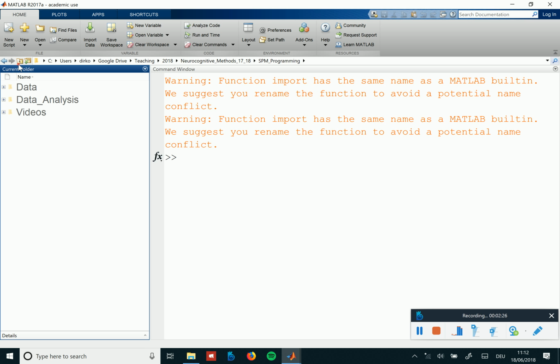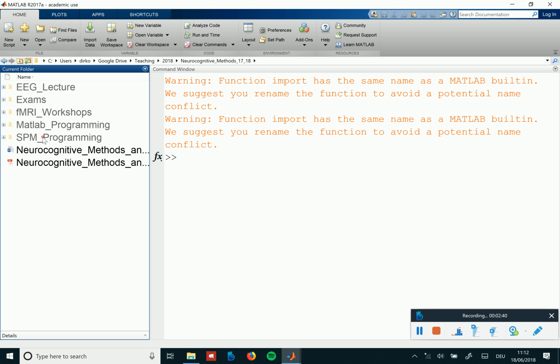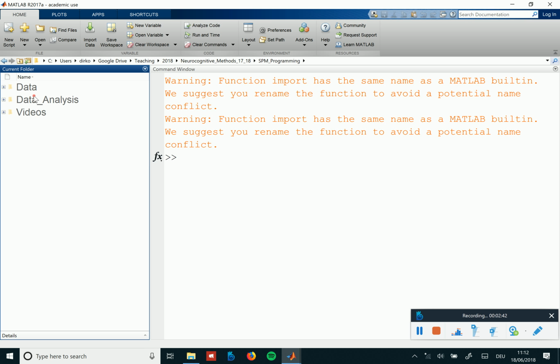And in this regard, we also know that these folders for the individual participants' data are in a folder called data. And as we also discussed, that we do the pre-processing and actually also the first level GLM estimation on a participant basis, it makes sense to structure the whole data management business into this.